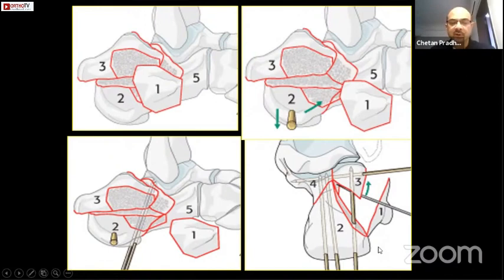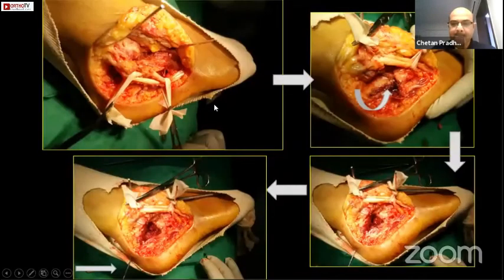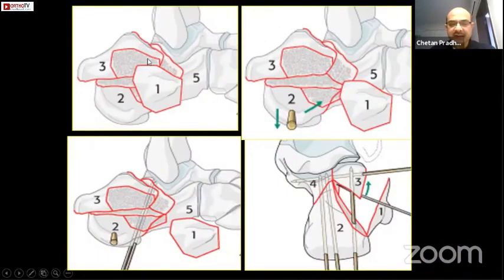Once you have identified these five fragments, you remove the first fragment — the lateral wall — you can even remove it on the table. Then you need to elevate fragment number three, templating on the base of the talus, and then pass a K-wire from three to four, and then an interfragmentary screw from three to four. Once you do that, half of your job is done — that is restoring the posterior facet.